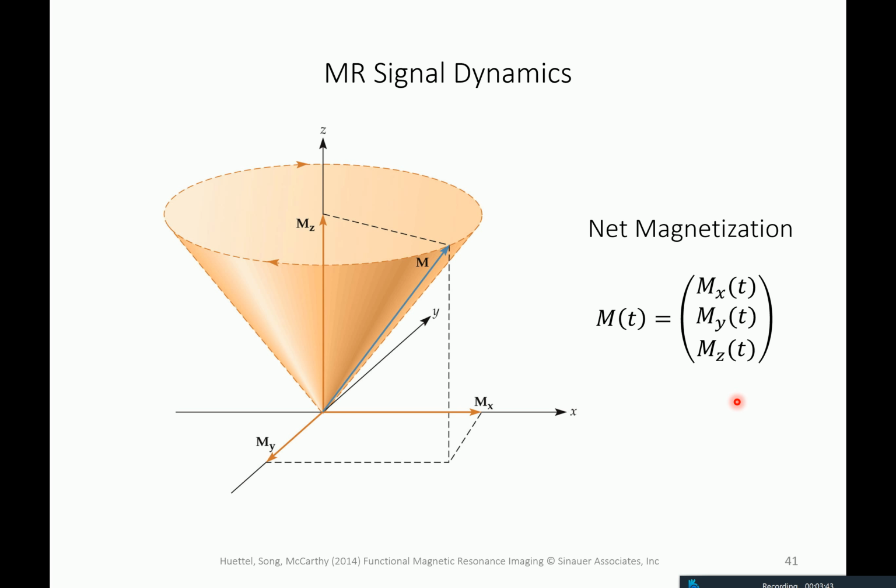Of course, for imaging, the varying of net magnetization and certain features of it over space is much more interesting, because we're interested in making images. But to really get into how images are formed, we need Fourier analysis, because what the MRI machine actually does is measure the Fourier transform of an image.